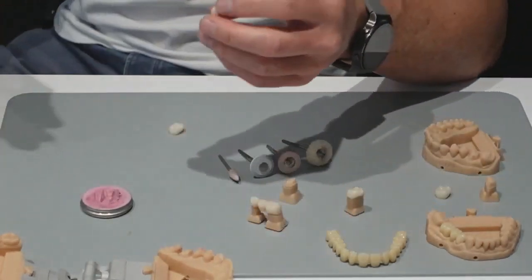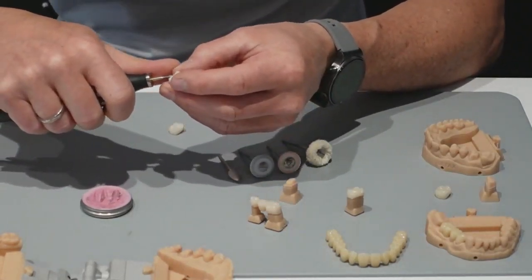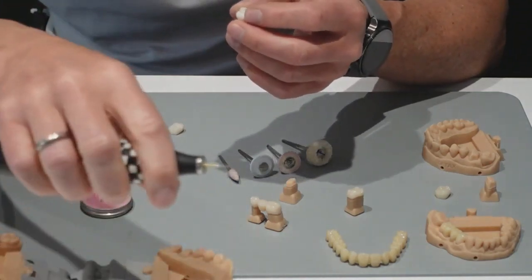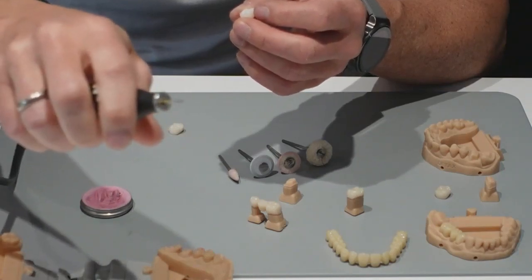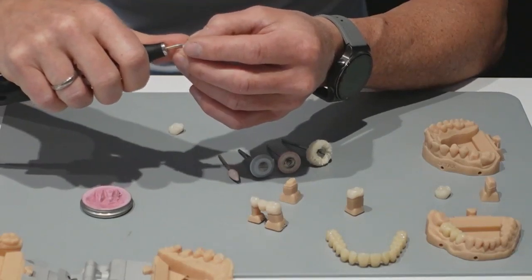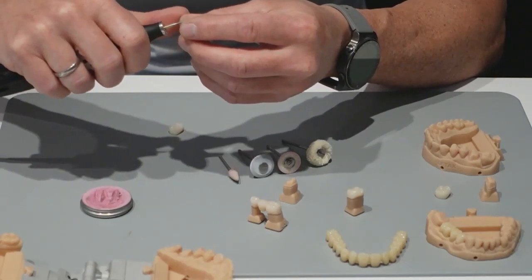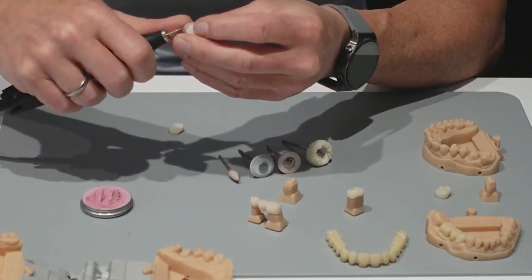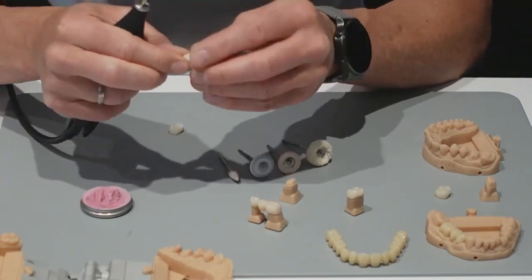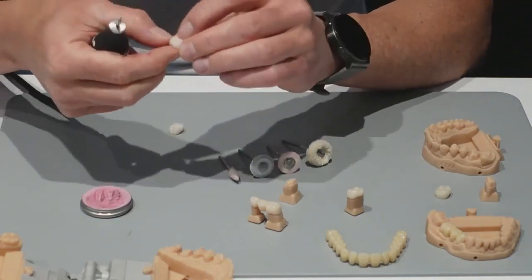To take this crown, we say in Germany to this milling tool a little flame. Maybe you can see it. It's a metal milling tool, and you go shortly over the surface, and you can feel it with the fingers whether it's okay or not.